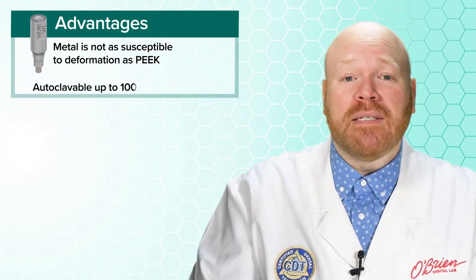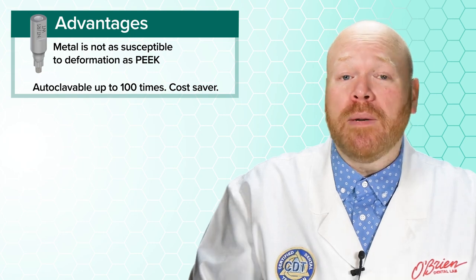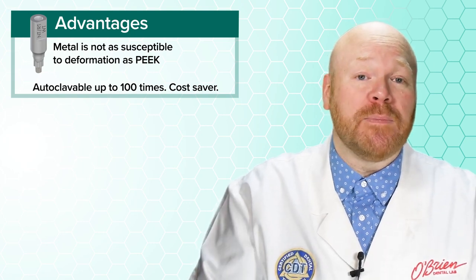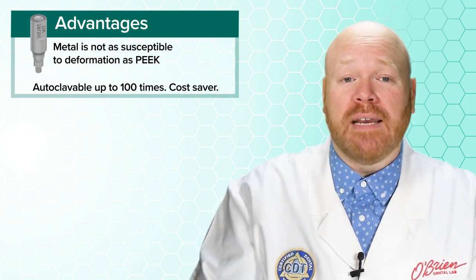Second, these metal scan bodies are autoclavable up to 100 times, and at the current price, that's less than 60 cents per use. If you restore a lot of Straumann implants, this is a huge cost saver.